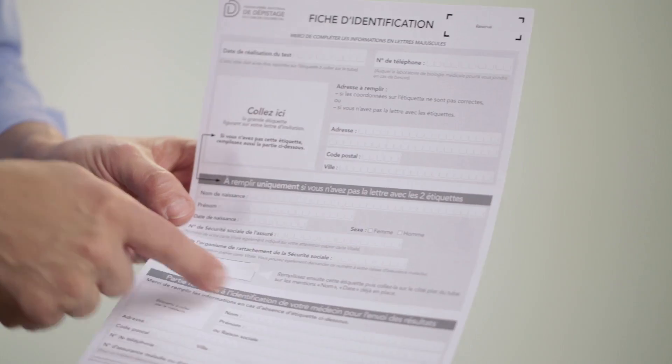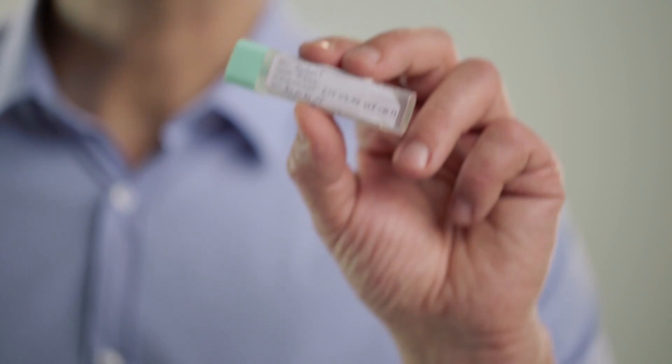It doesn't matter if you haven't received a letter. You will need to complete the central part of the identification form, including the small label, which you stick on the tube.